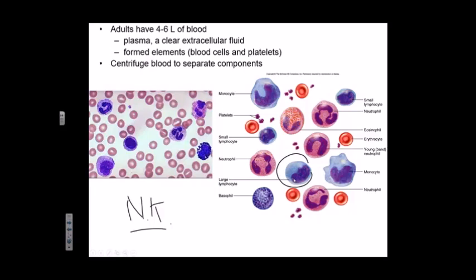We'll talk about the physiology of natural killer cells when we get into immunology. In fact, most of the details of all these cells are going to be talked about in immunology, not here. But you have to recognize these cells, because some of you may have to recognize them in real life in your career. It's not hard, it's easy. All you have to do is get used to the morphology of these cells.